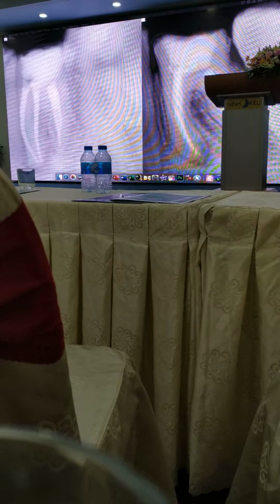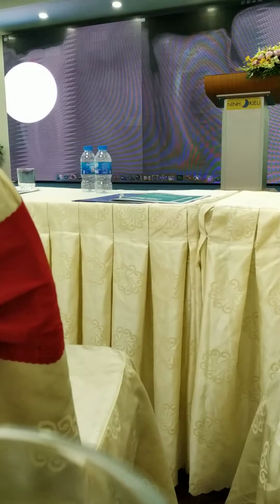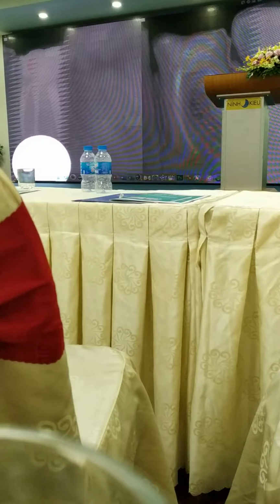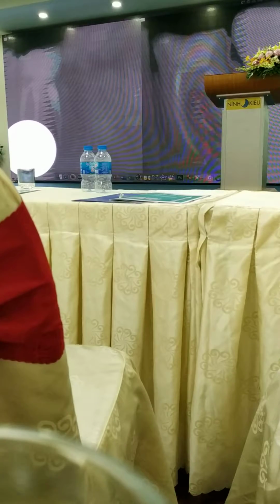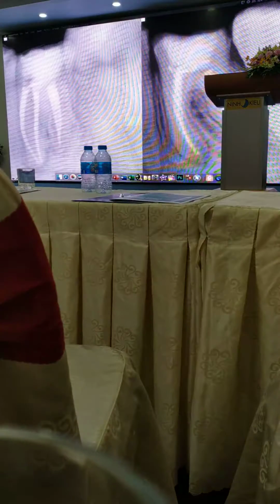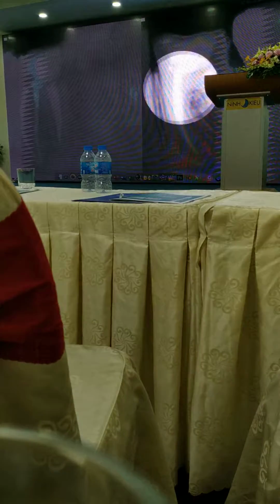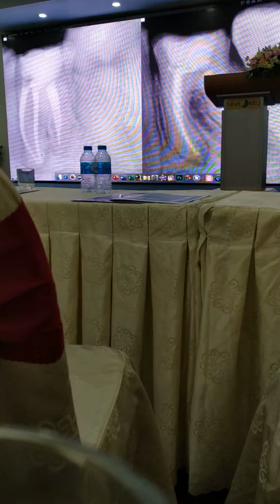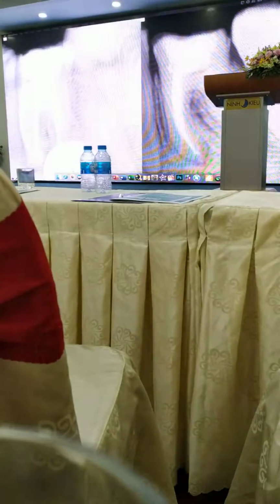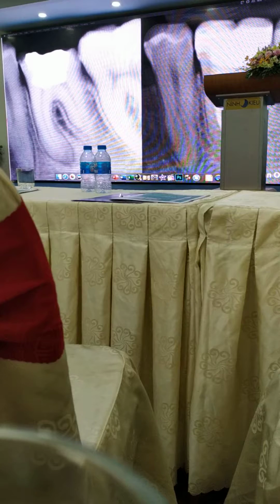And as you can see, we have here a big curvature of the mesiolingual canal. With our lateral compaction technique, filling properly these curvatures is impossible. And that curvature is not visible in this radiograph. But in this radiograph, this long curvature is really visible. Now we finished, then we sent the patient back to the prosthetic department, and this is the final result.